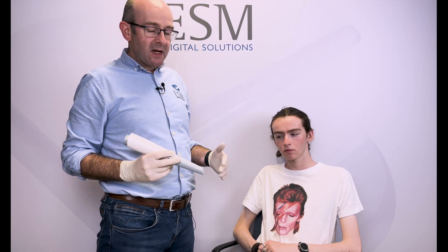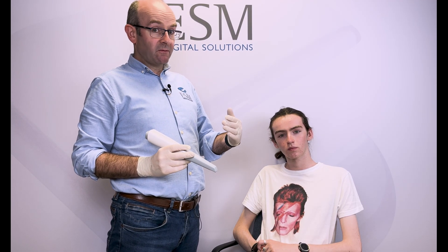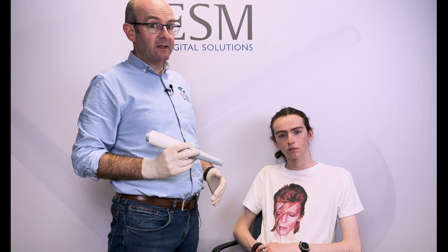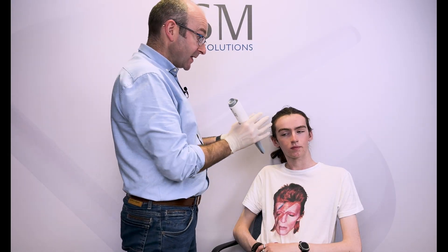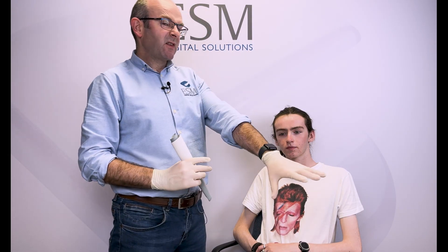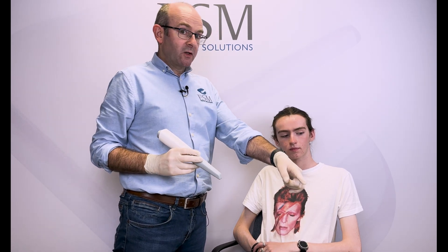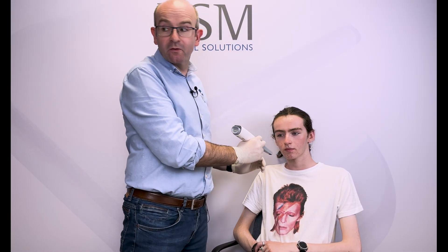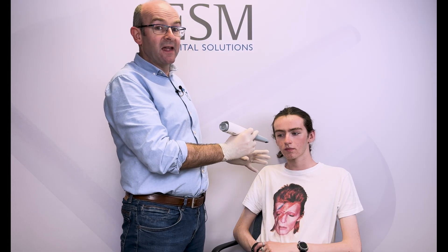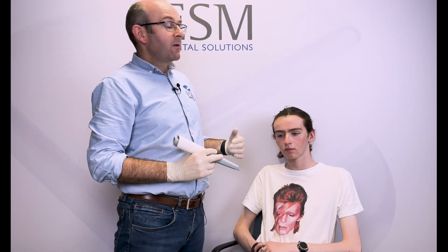The principles are the same whether the patient is sitting up or lying down — we follow the same scanning strategy. What's really key is that the screen is in a very visible and ergonomic position. Ideally the screen would be positioned so you can see the patient and the screen in the same line of sight. What we don't want is the screen behind us so we can't see what's going on, or having to choose between watching the screen and focusing on the patient.